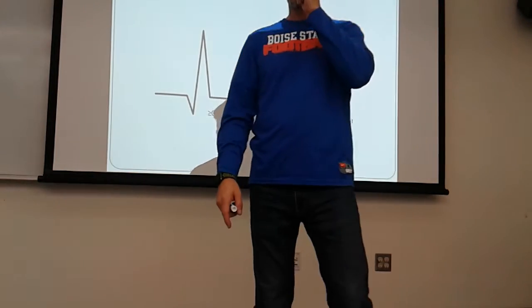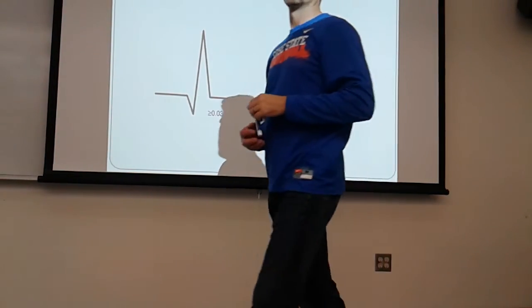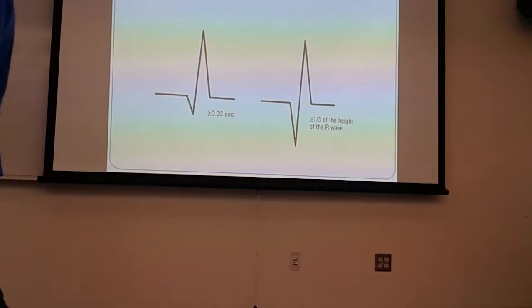So a larger Q wave, like you said, is indicative of a past MI? Correct. So you wouldn't see that, like, if you keep doing 12 lead after 12 lead? No, you might. It's indicative of dead tissue whenever it died. So, for example, if you have a patient that is currently going through an MI, and their heart is pretty progressed in that MI, and you're doing serial EKGs, it's quite possible that that tissue does die on your watch, and you will see the Q waves form on your EKG.